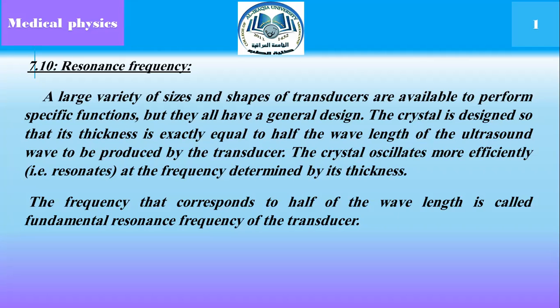The crystal is designed so that its thickness is exactly equal to half the wavelength of the ultrasound wave to be produced by the transducer. The crystal oscillates more efficiently. The frequency is determined by its thickness.